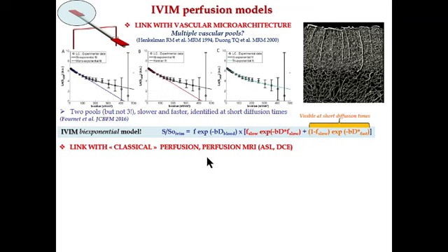The other question that we all face is how could we link IVIM parameters with classical perfusion, or ASL or DCE? In fact, this was a question that was provoked by Mark Henkelman back in 91 or 92. Does IVIM measure classical perfusion?